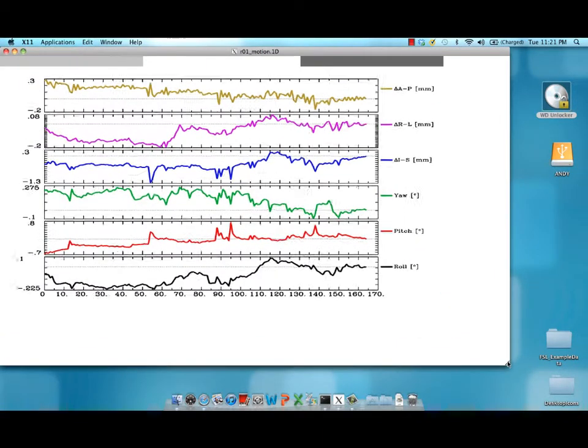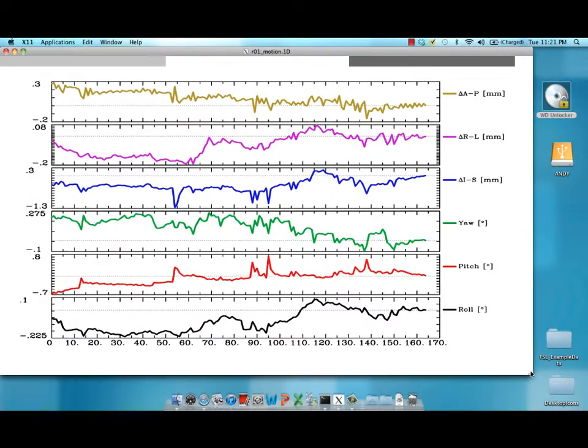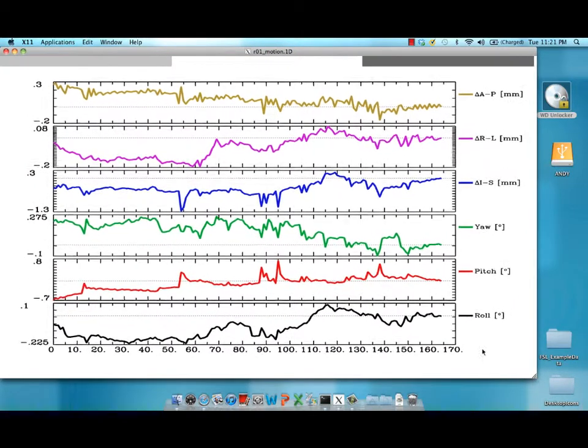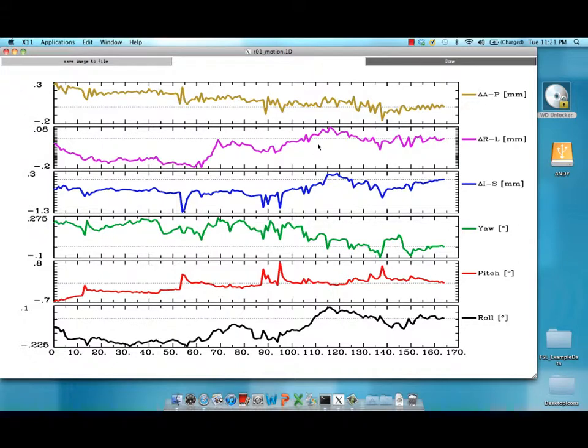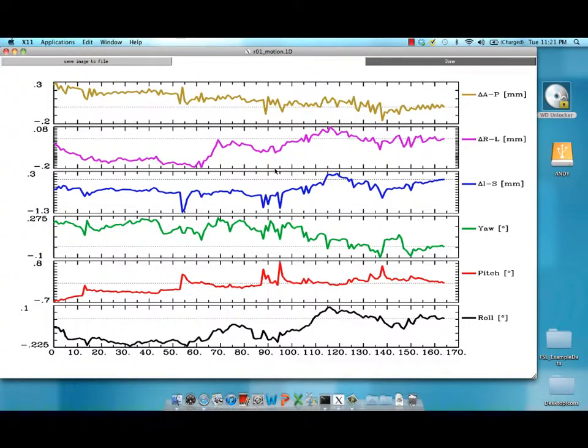If you look here, you'll see a time course of the motion for each of these different movement parameters. By just visually inspecting it, you can see that there was a slight motion at around time point 96.